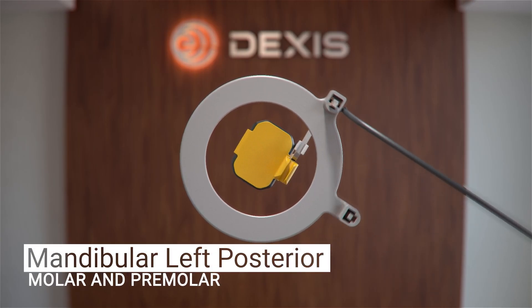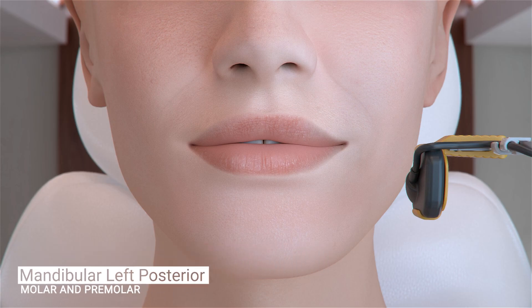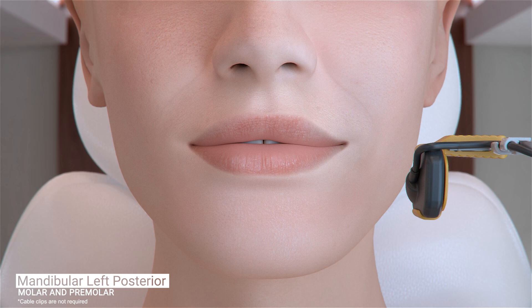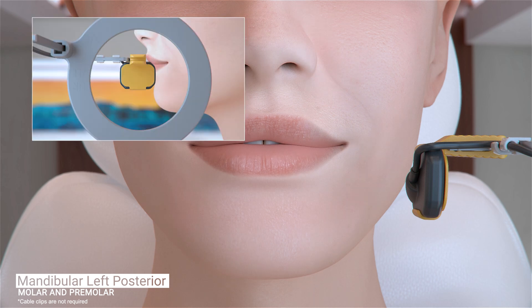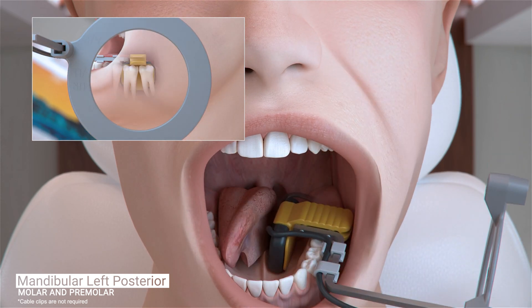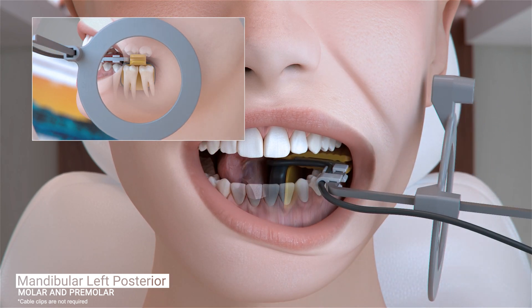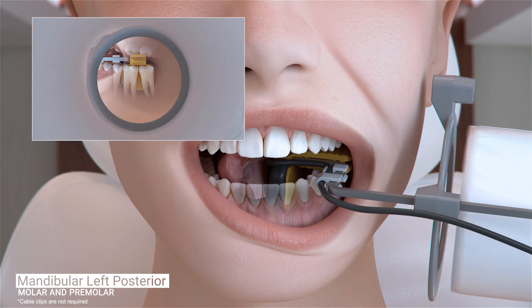The configuration of the sensor and holder does not need to be adjusted for the next image in our full series, which begins with the patient's mandibular left molar. Position the sensor so it is parallel to the roots of the teeth in the occlusal line and centered on the first molar. Place either next to or over the tongue, whichever is most comfortable for the patient. Ask the patient to relax and close. Slide the aiming ring as close to the patient's jaw as possible. Place the X-ray emitter cone flush with the aiming ring and trigger your exposure.